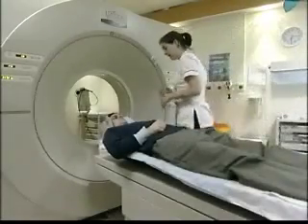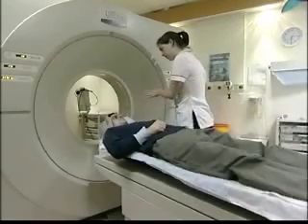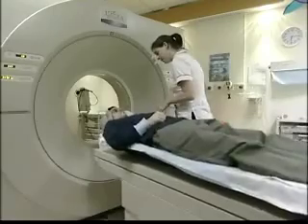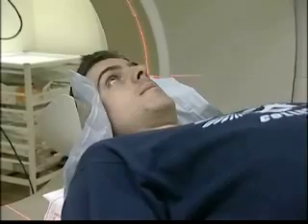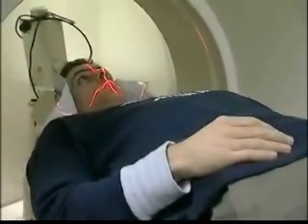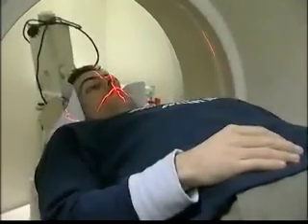I'm going to take some pictures of your head now. I'm just going to raise the bed up and get you into position. An initial x-ray of this patient revealed a fracture. However, the doctor responsible is also worried that there might be damage to the top of the spine, so a CT scan is being performed. Alan is now being placed in the CT scanner and the radiographer uses a laser beam to place his head in precisely the right location.